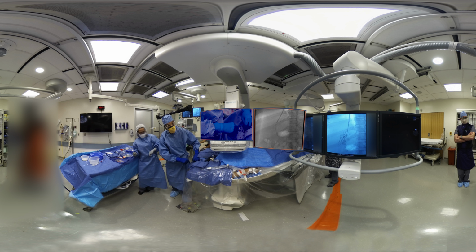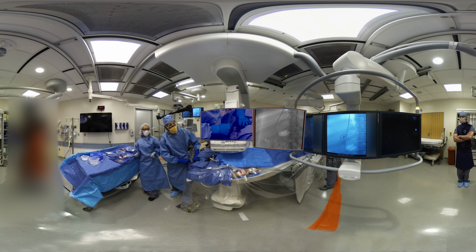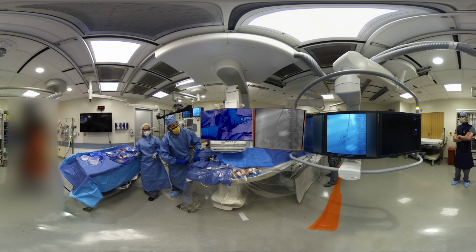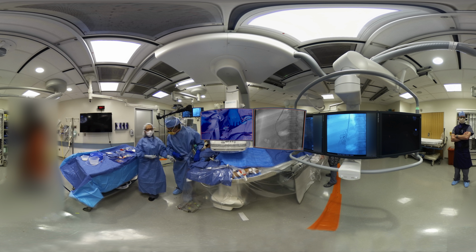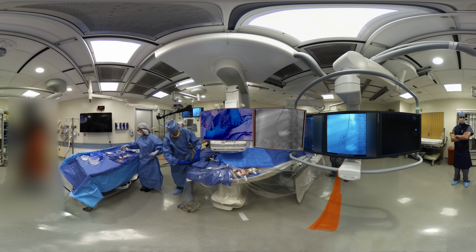Okay, you've got the wire, and you can see the tip. Let's keep it taut. A little bit of momentum is important here. Jump across, and there's our jump. Okay, you know, I think I'd like a longer catheter. Let's go back to that black one. This was a, I think this was a 65. So we'll go to the Van Andel.